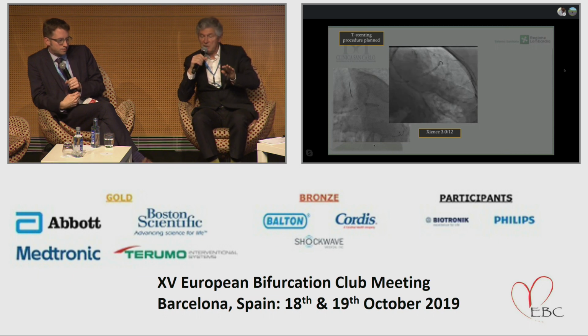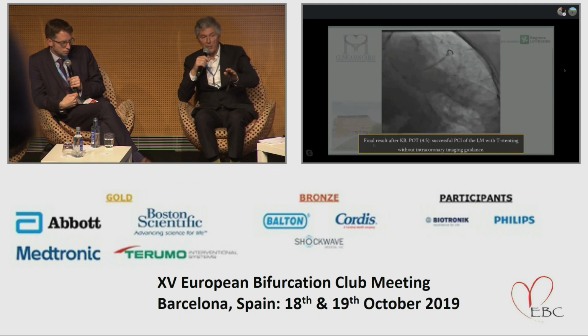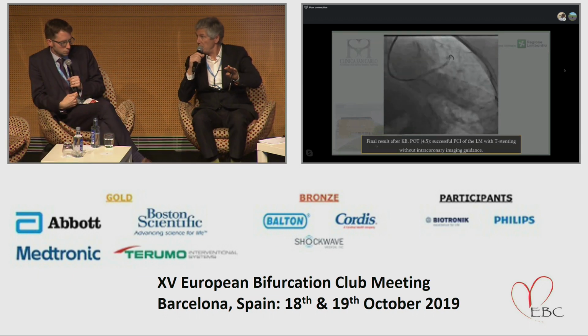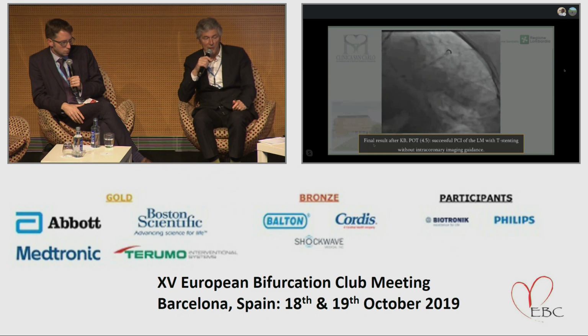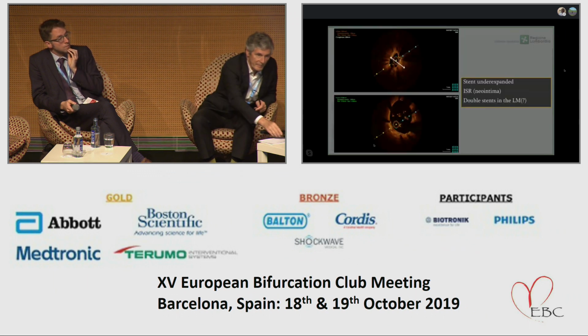But what is important is how you can solve this problem by using intracoronary imaging, because in fact, I think by intracoronary imaging, you understood that there was really a problem that you cannot solve easily, and the images can help you to solve this issue. So maybe you can continue and give us your explanation and what you have done. Yes, I'm going to read.